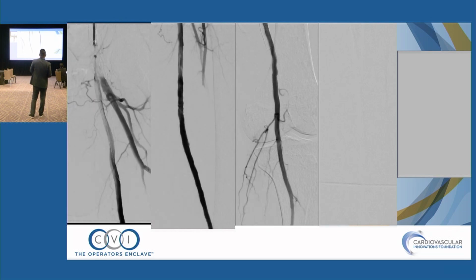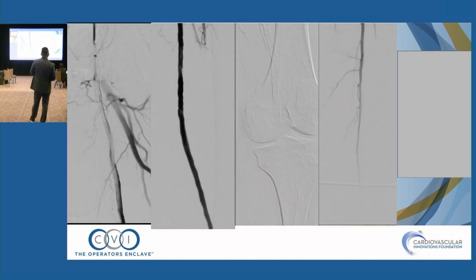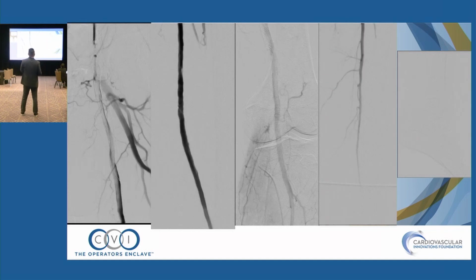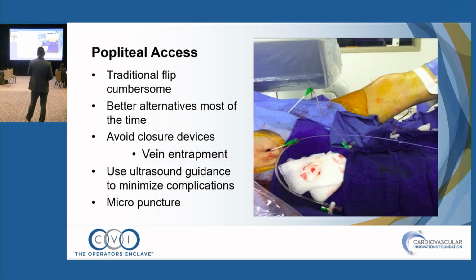Sorry, I'm supposed to play all at the same time, but nice result. All right, so again, just an example of where SFA access potentially can help and make things easier. So popliteal access, there are ways to do this without flipping the patient. Again, I haven't done popliteal access in probably years now, because most of the time you don't need to.